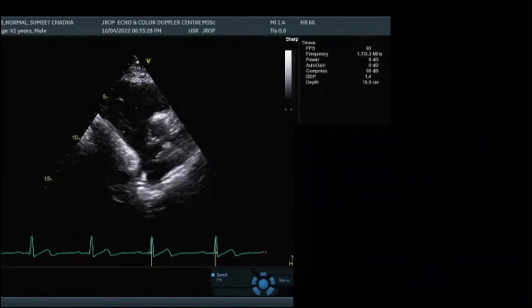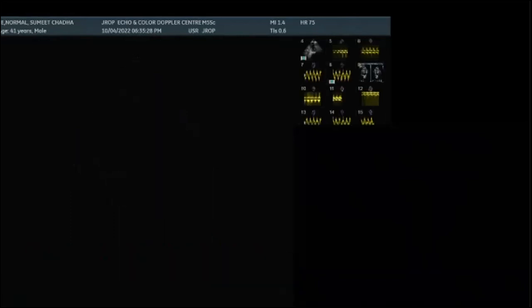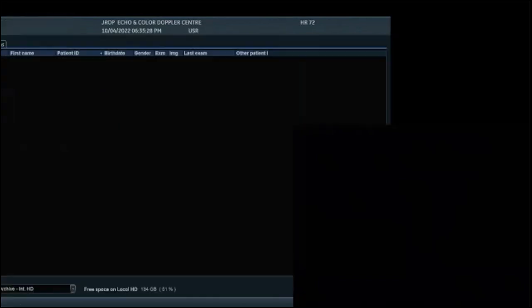Sir, my question is, any tips and tricks for mitral tracing in case of atrial fibrillation? In mitral tracing in atrial fibrillation, take as many measurements as possible. Give me a second, I'll show you.